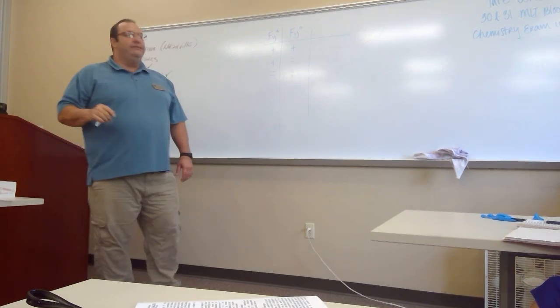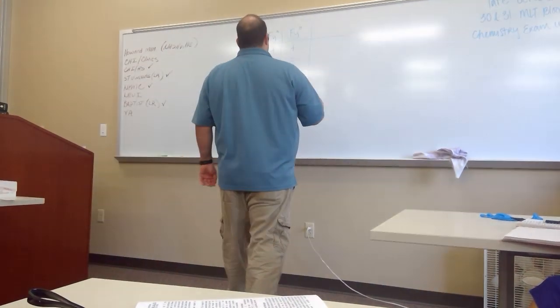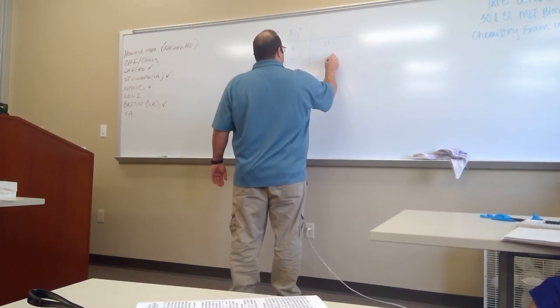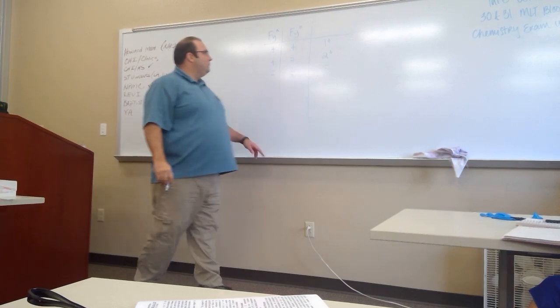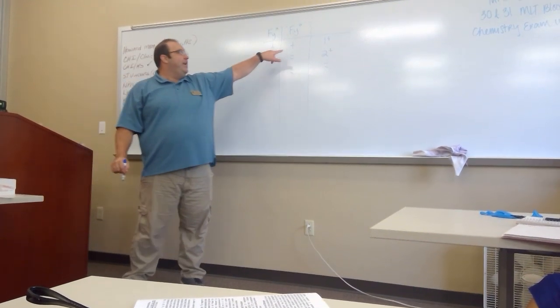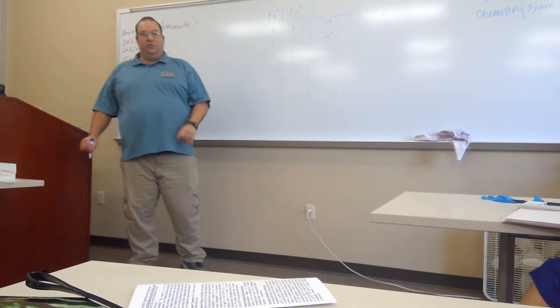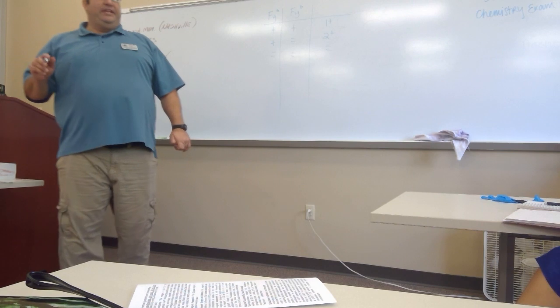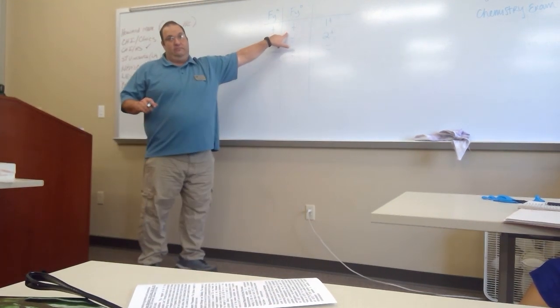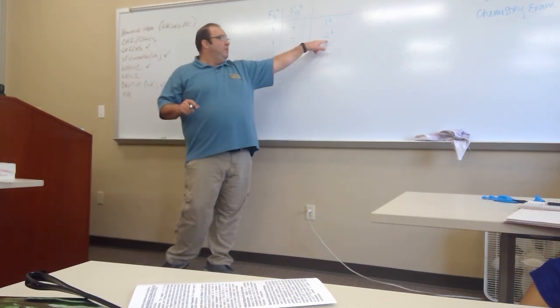Let's say our culprit is Duffy A. So at Coombs, on this one, maybe we get 1 plus, 2 plus, and negative. This is showing a weaker expression because it is shared. It is heterozygous. It's shared on the allele. It'll show dosage, which means it shows less reactivity when both of them are present. This one occurs by itself, so it shows up much stronger.